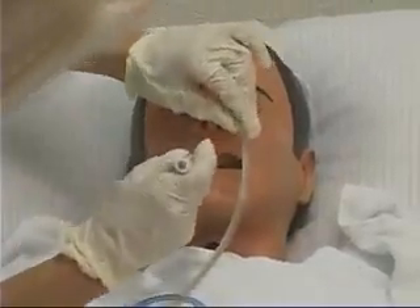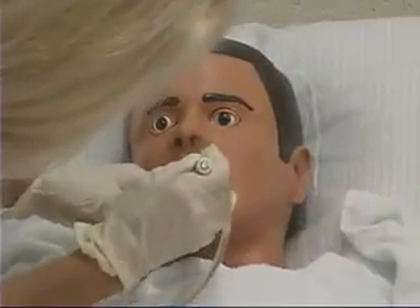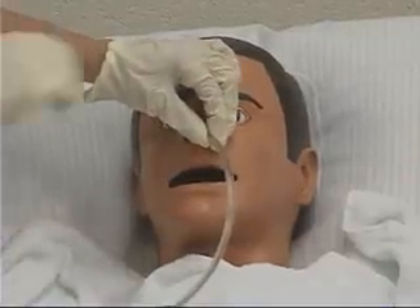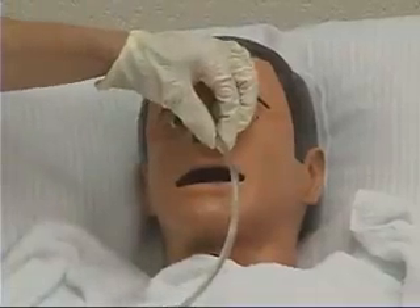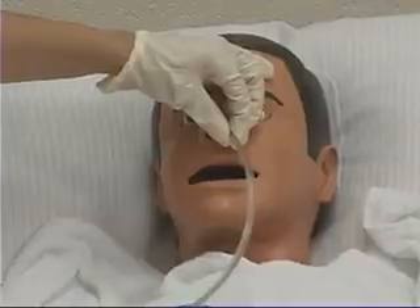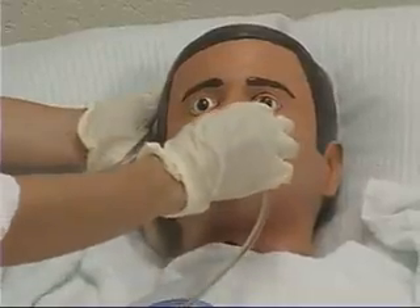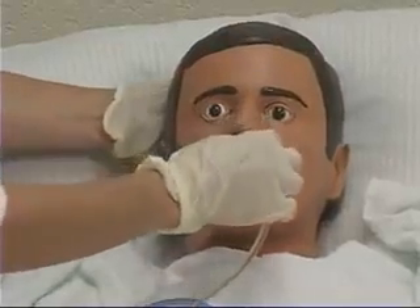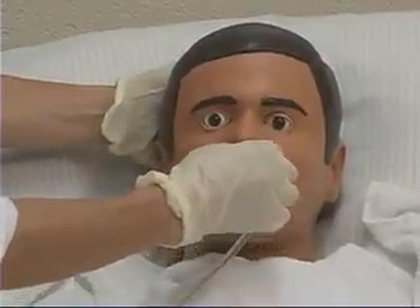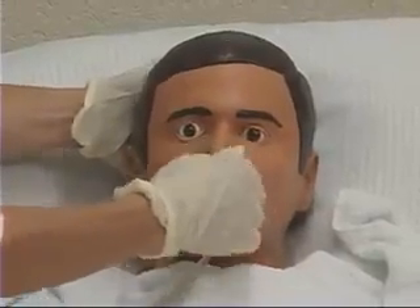When the tube reaches the nasopharynx, resistance will be felt. Have the client open their mouth and check with a penlight to visualize the tube. This helps confirm the tube is at the back of the throat and not coiled up inside the mouth. Ask the client to take a sip of water several times while advancing the tube until the tape mark is reached. If the client gags, briefly stop the tube advancement.